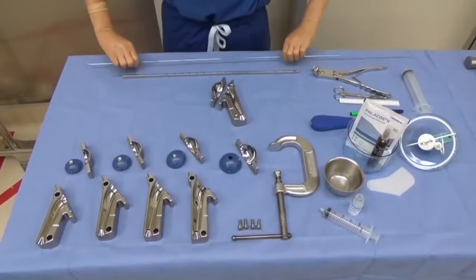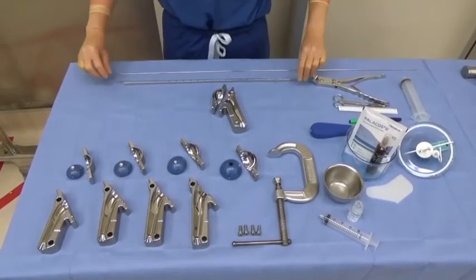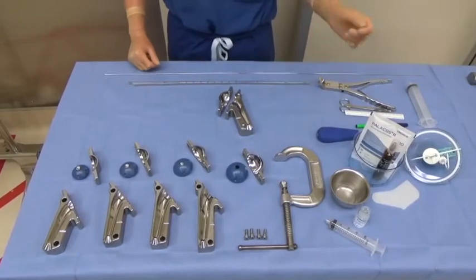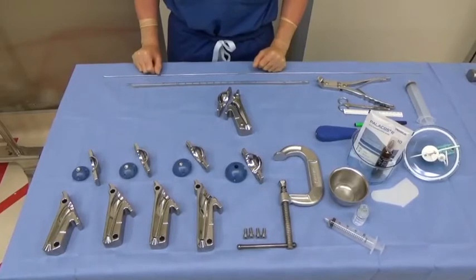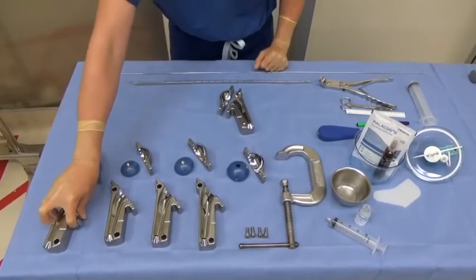In addition to standard revision equipment, the construction of the antibiotic spacer will require a metal guide wire, chest tubes in a variety of sizes, mineral oil, cement, antibiotic powder, and commercially available proximal humerus antibiotic spacer molds that come in the demonstrated sizes.